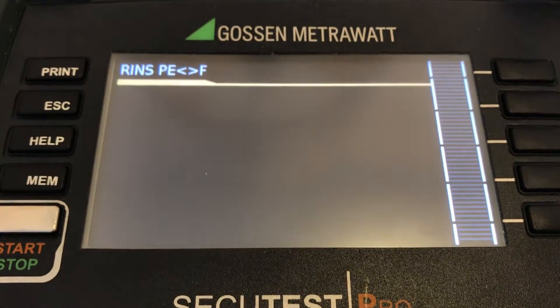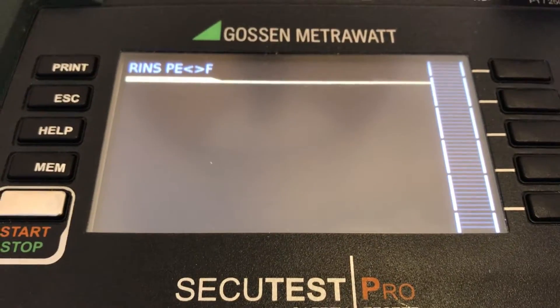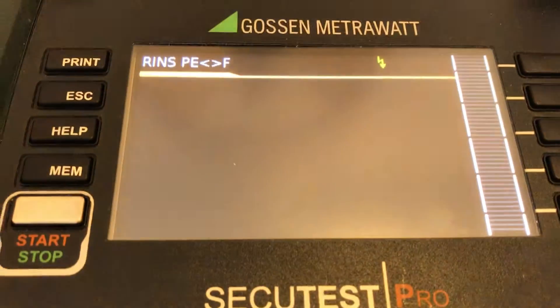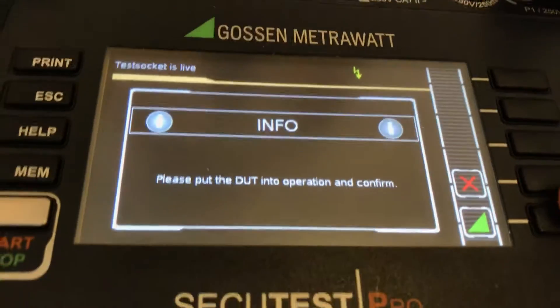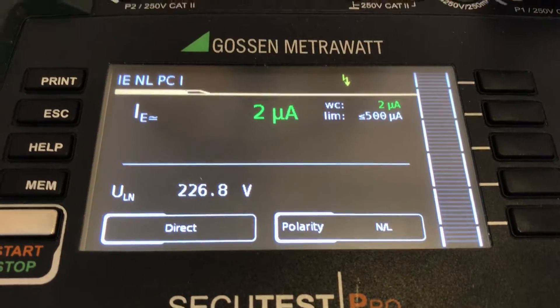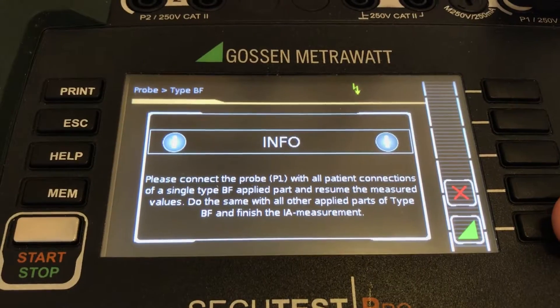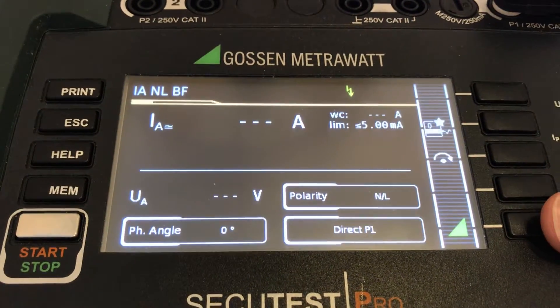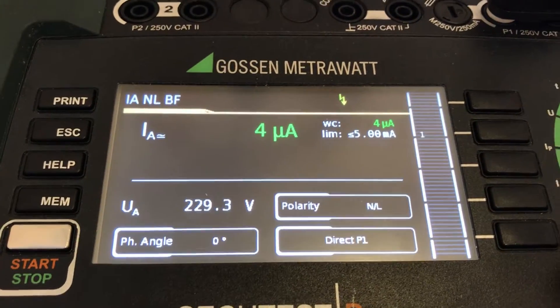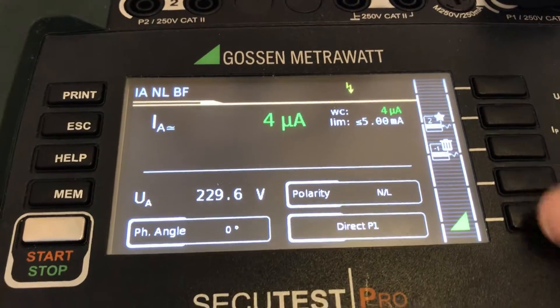Now we're measuring the insulation from the conducted applied parts. It gives us a warning that we need to switch on the device under test. We're confirming all these steps to move ahead. This is a manual measurement section where we have multiple parts — we can conduct all the different types of parts and test them on the same unit.